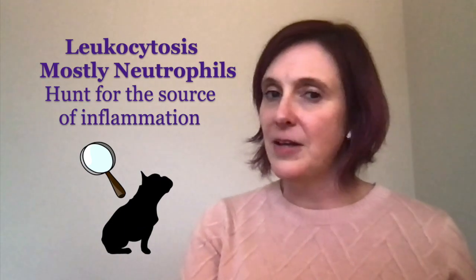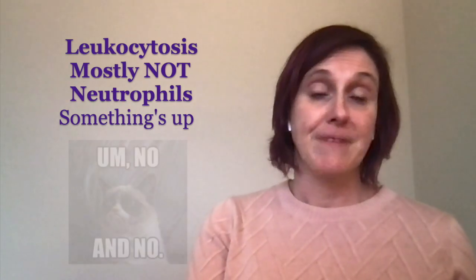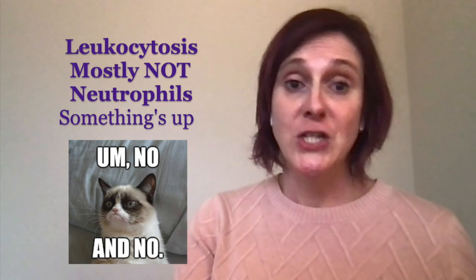If we look at that blood film and we're like, there's a lot of nucleated cells here, and they're not all neutrophils. There's a lot of somebody else here. You're definitely going to be having a slightly different conversation with your owner. Like, there's some kind of fishy cells on here. We're going to be thinking about inflammation, but I really want to get a path review on this particular slide.